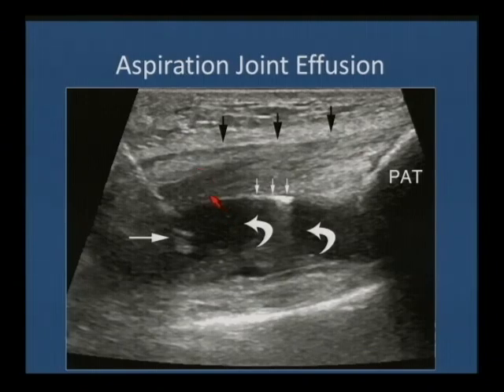Sometimes the question is, are we dealing with a septic joint? And we'll be asked to evaluate the knee if there's fluid to tap it. And then we have a very big joint replacement service, and replace joints that the orthopedic joint surgeon suspects may be infected. Well, it's not uncommon for us to be asked to scan the knee, and if there's any sign of fluid, to tap it and send it for laboratory analysis.